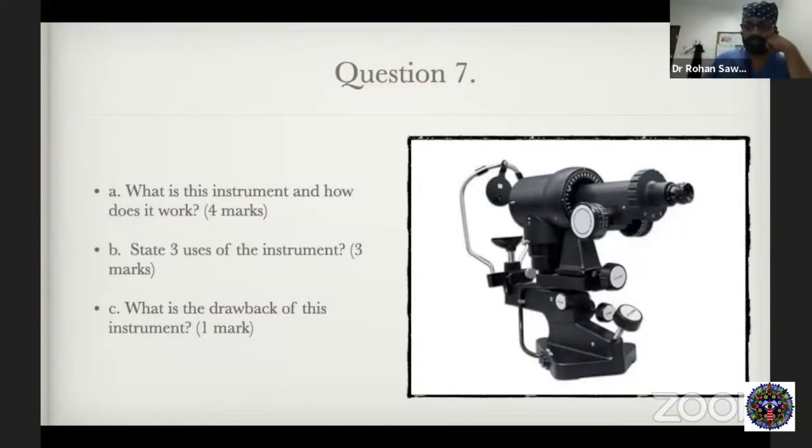Well done. What else? What are you measuring? You're measuring corneal astigmatism. Yes, you can also estimate the radius of curvature for contact lens fitting. That's one advantage of using a keratometer. It can also be used to measure surface irregularities, for example, caused by pterygium or keratoconus. And preoperative evaluation in routine cataract surgery.